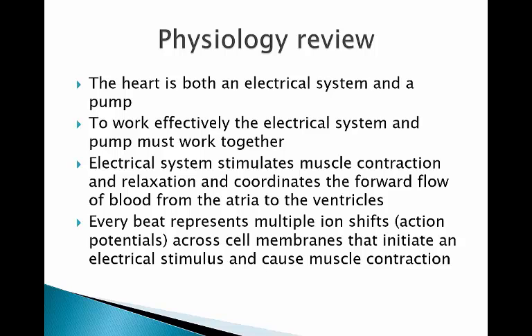Okay? So we're going to talk about a dysrhythmia where you will see an electrical beat or beats go across the screen, but the heart's not pumping. Okay? That's something called PEA, or pulseless electrical activity. It looks like the patient has a heartbeat, but they do not. All right? So a lot of dysrhythmias are due to electrical system failures, okay?